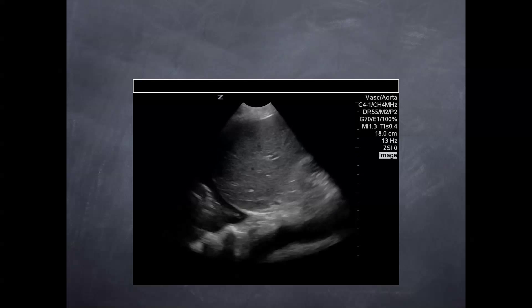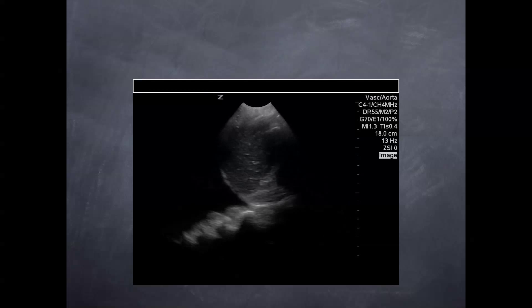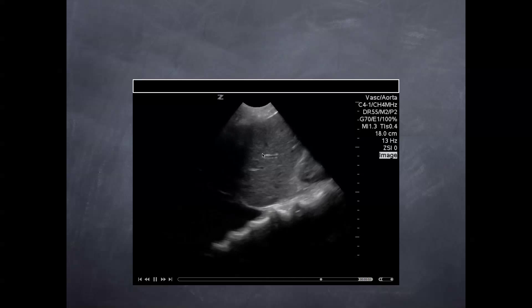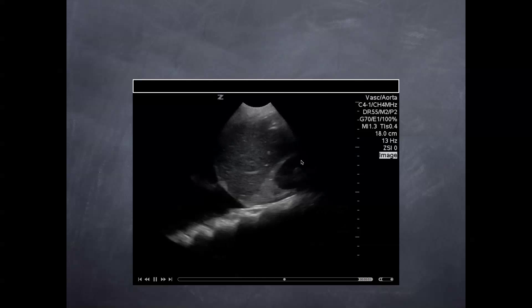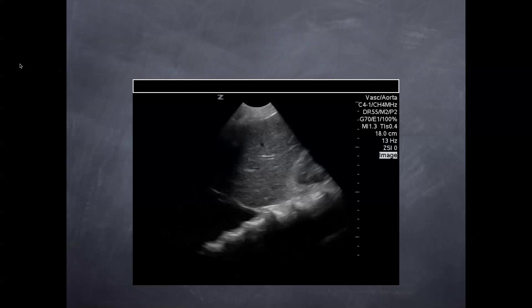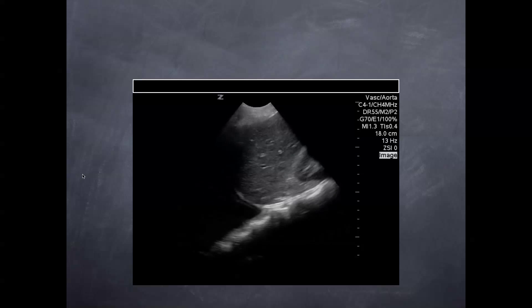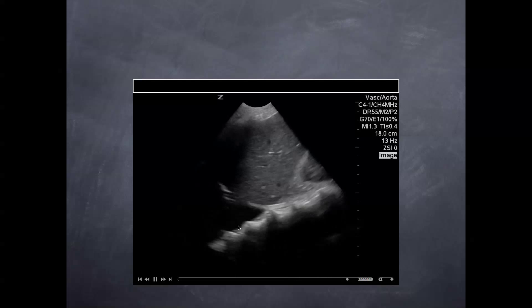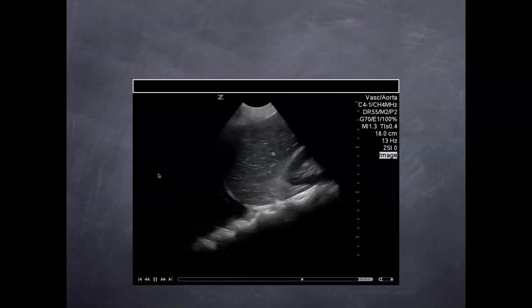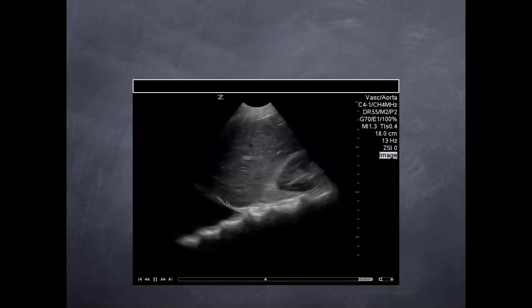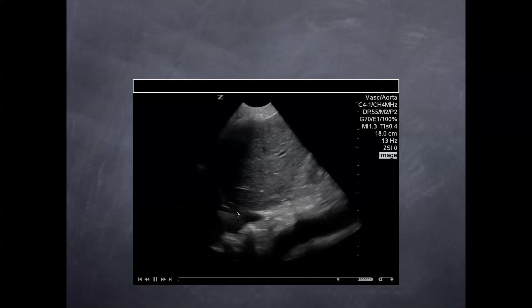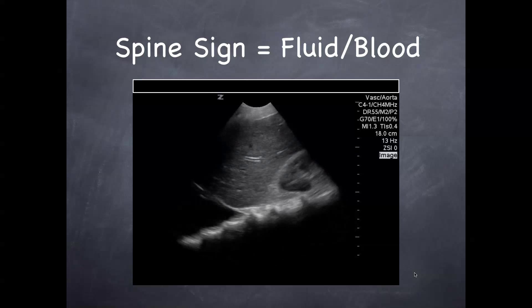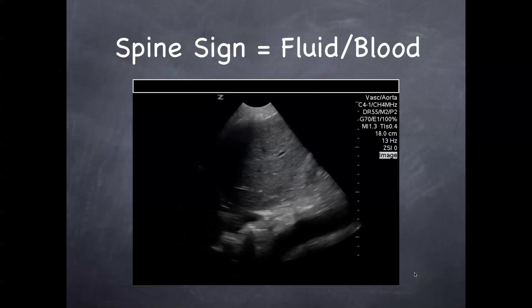We talked about this a little bit earlier. This is your right upper quadrant — you can see some ducts in here, and this is the liver. Kidney, probe pointing towards the head. The spine sign is here — you know something's abnormal. In this case you can see some of the lung flapping, and you can see a big effusion here as well, or blood.